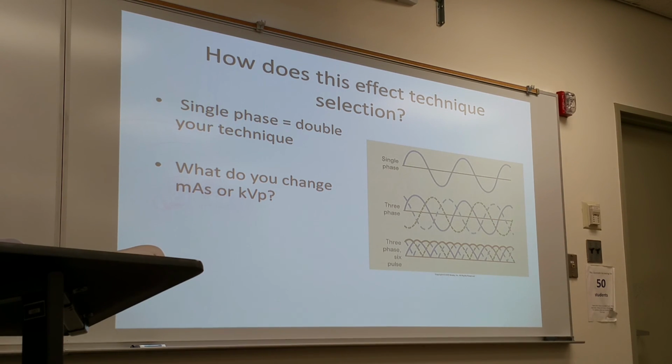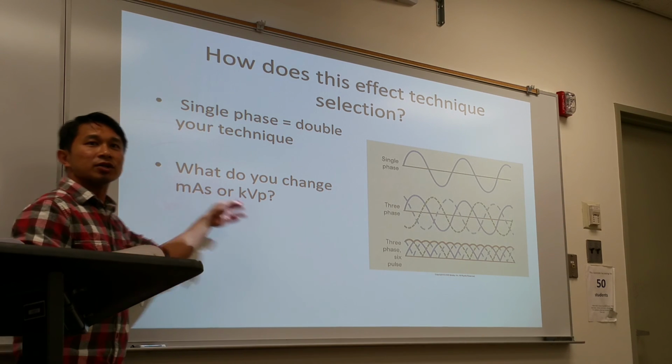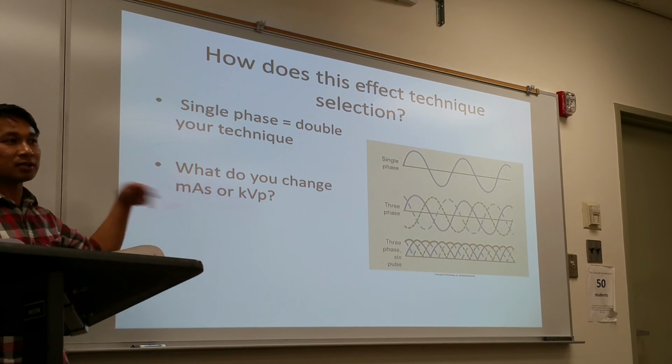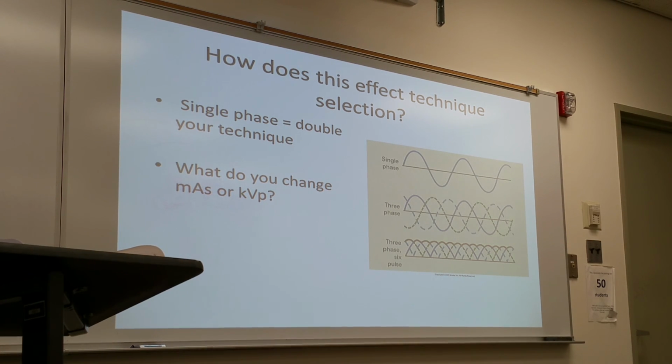And what do you double? As a general rule of thumb, kV stays consistent. You change the mAs. From a three phase room to a single phase room, you normally double the mAs. It said two-thirds, but I don't have time to calculate what two-thirds of 7 is. I just double. Otherwise, your image exposure will be too light. Insufficient.